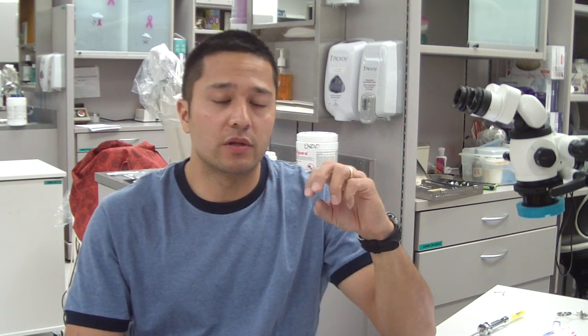We're obturating a canal system with MTA. The idea, and I was talking with our endodontic mentor Dr. Crossfit, is that perhaps if you have, for a number of reasons, you want to obturate with MTA, whether it be the apical third or the entire canal system, be it you have a blunderbuss or blown out canal system apically.